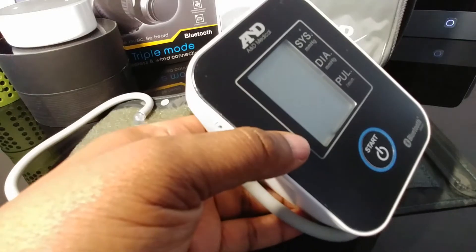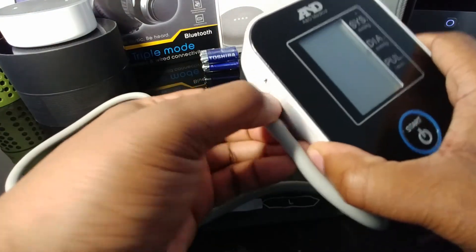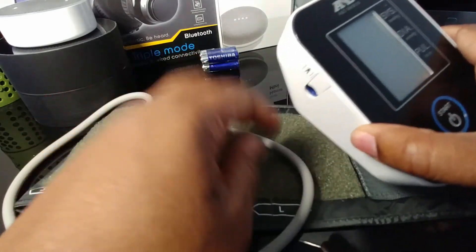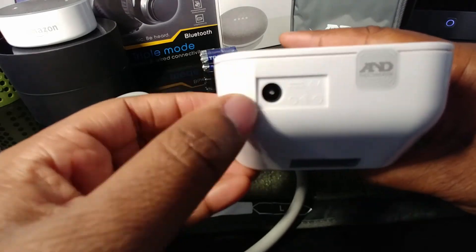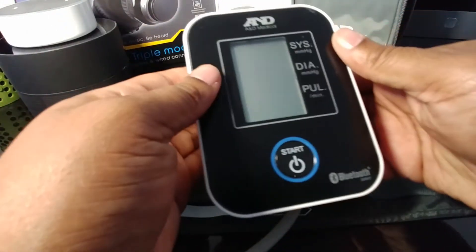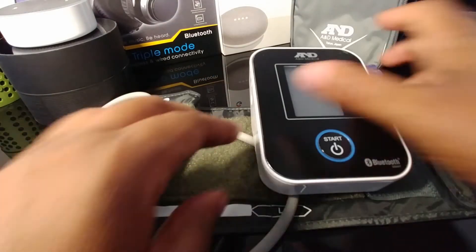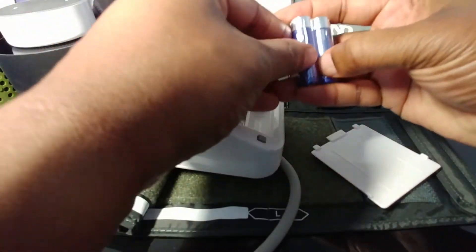Once you have the batteries in, you press the button to start it and it'll give you the information. You can also download the app. Another added bonus — if you run out of batteries you can always use a six-volt adapter. It doesn't come with one, but you might even have one laying around the house. Let's go ahead and put the batteries in and power it up.